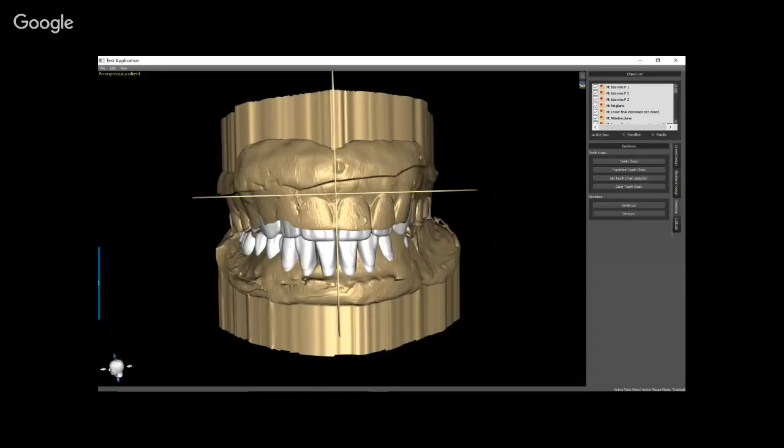But there's also a number of studies that show different measurements of, okay, for the average distance of the incisors is so far down and so far forward of the incisive papilla. Again, we can use that as an anatomic reference. And these studies, and there's a bunch of them out there, I didn't include any of them in the presentation, sorry, but look at these studies, and what you're going to come away with is basically a range of so far down and forward of the incisive papilla.